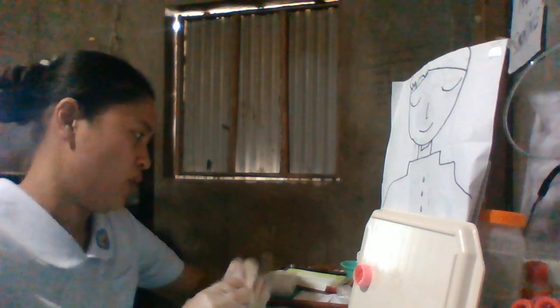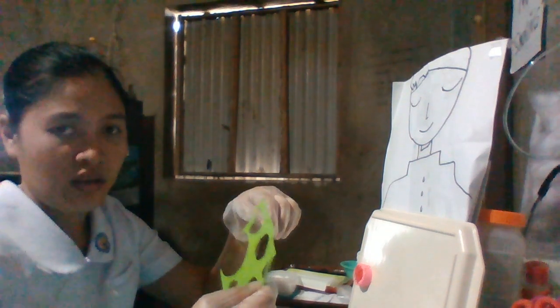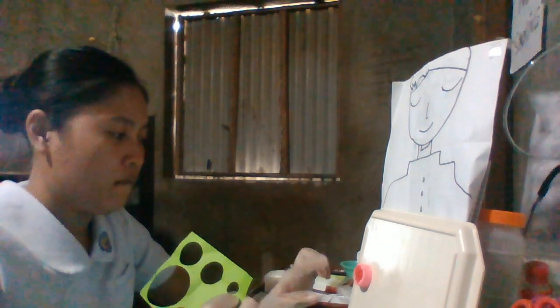Then next, use the guide to measure the size of the skin barrier so that it will fit when we apply it. So we have sizes here. We can size it so that we have a guide for the stoma opening.